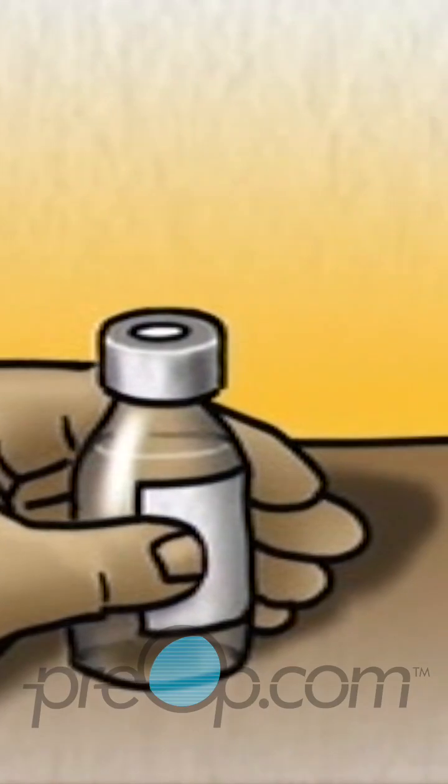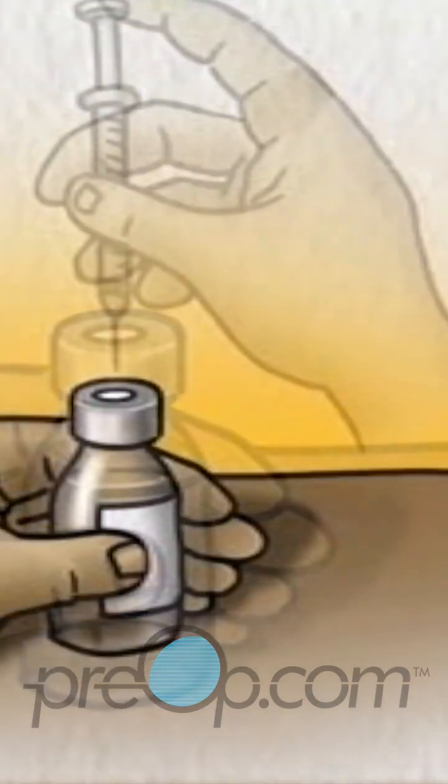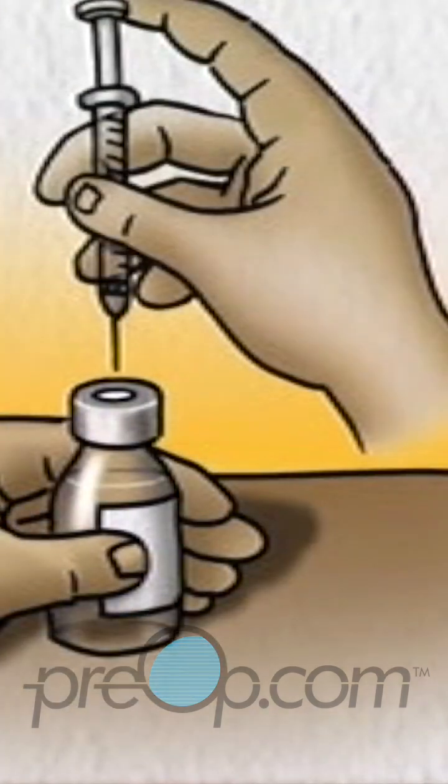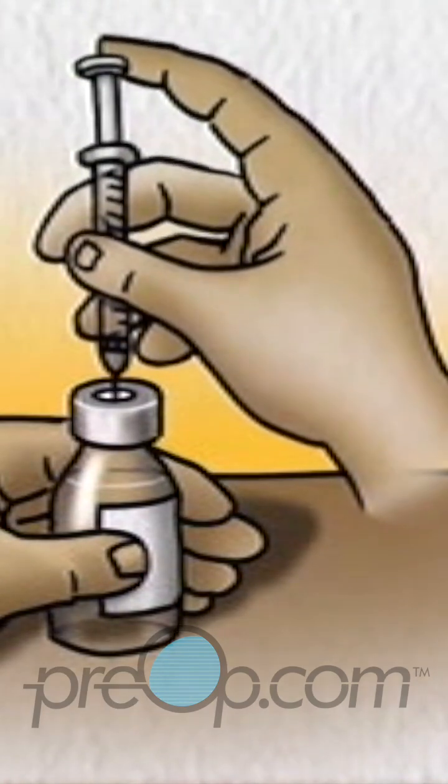Check the insulin bottle to ensure you have the correct type of insulin. With the insulin bottle held firmly on a counter or tabletop, insert the needle through the rubber cap into the bottle.